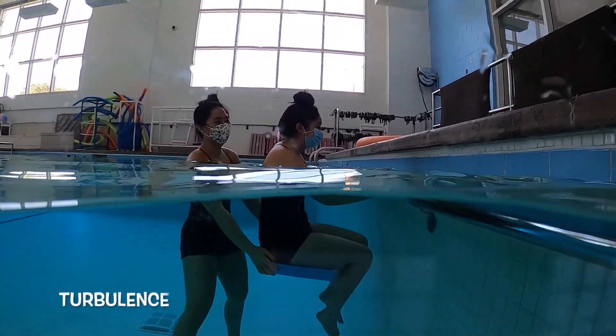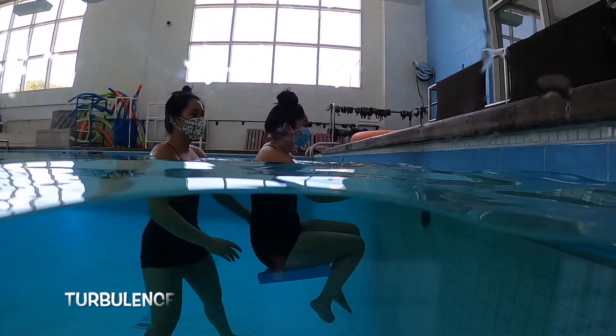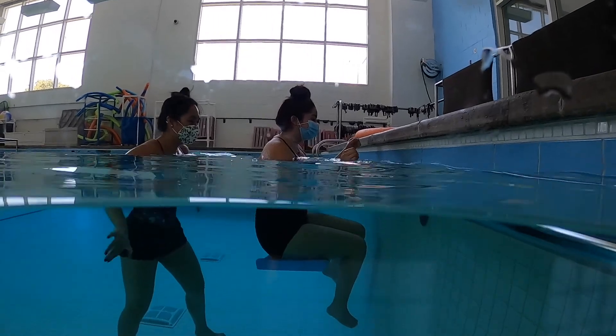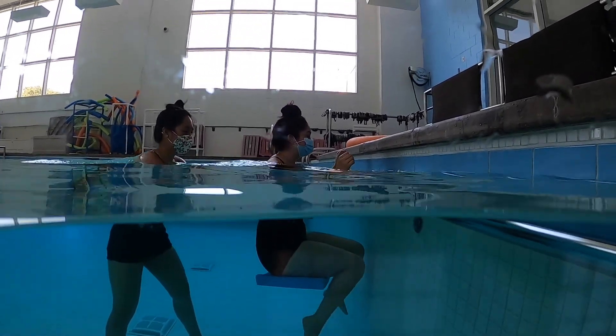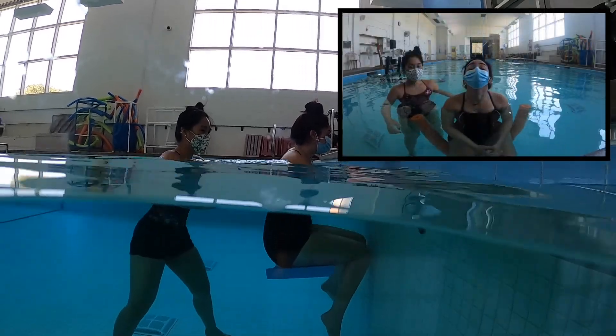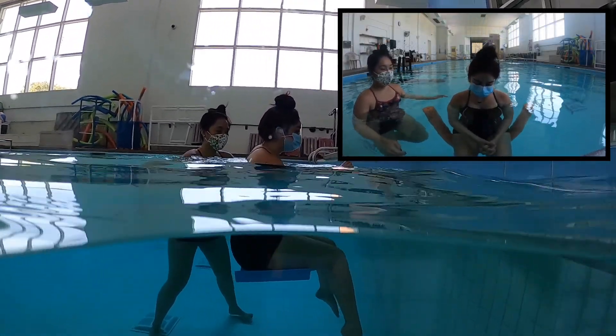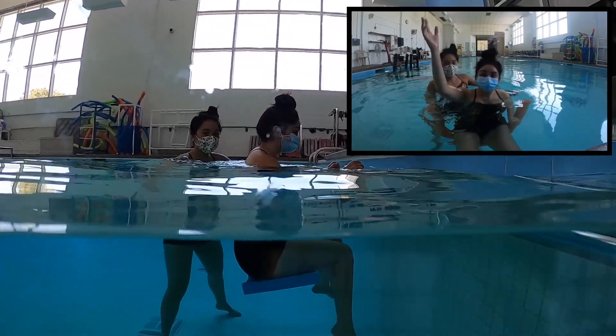In this video, you will see the balance board be used in a variety of ways to help clients improve their balance and proprioception. Exercises shown in the video are examples but are not limited to meet the needs and goals of all clients. Exercises shown on the noodle in the top right hand corner can be replicated using the balance board.